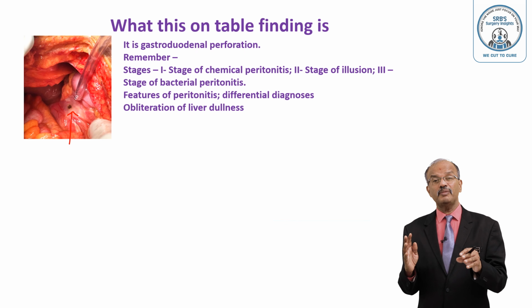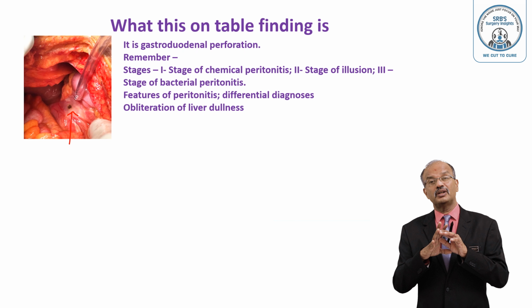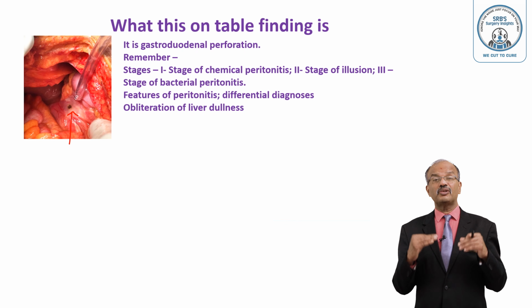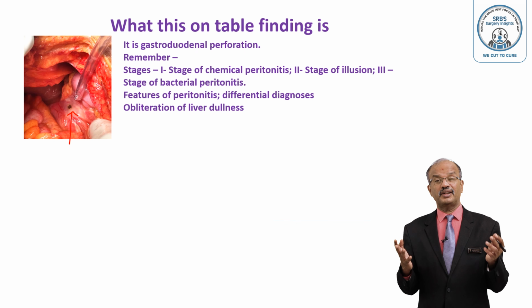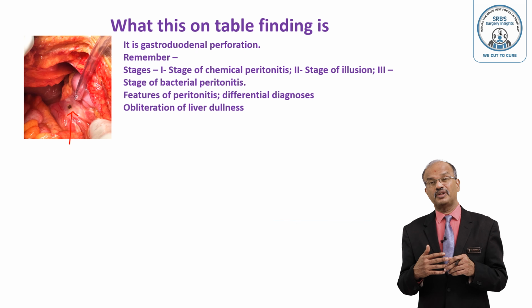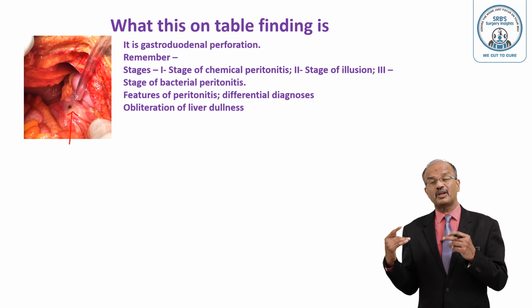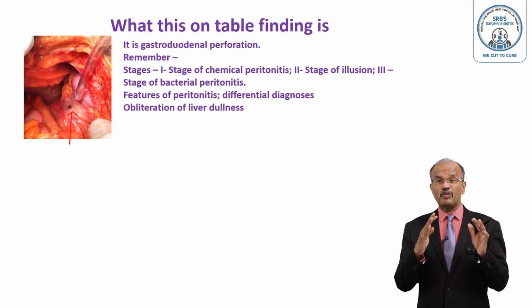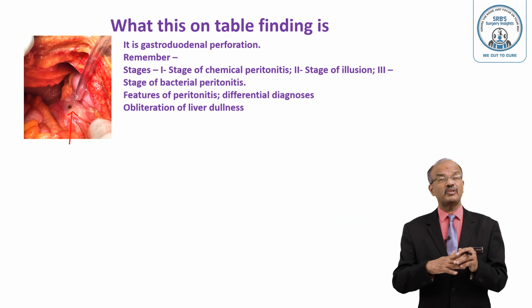After placing the omentum, 3 sutures are placed. 1, 2, 3. 1 and 3 you have to put first, next the middle one, the last middle one you have to put after placing the omentum. That is called the Graham's patch, Cellan-Jones technique. In the modified Graham's operation, you close the perforation, then put the omentum. So different types have different names. Cellan-Jones is commonly used.